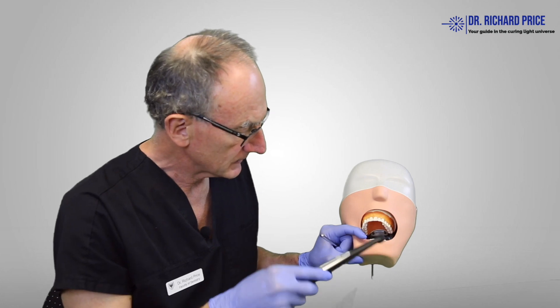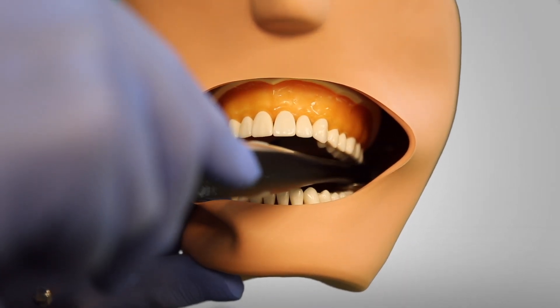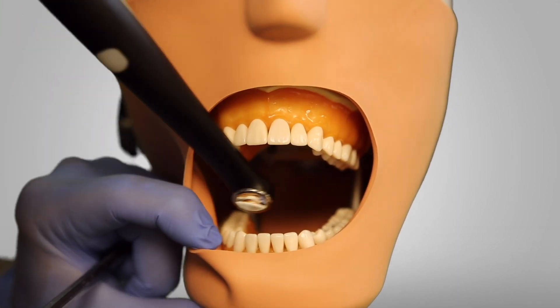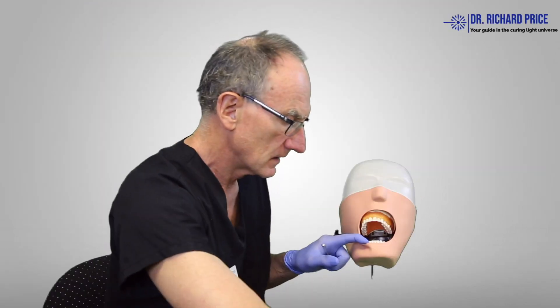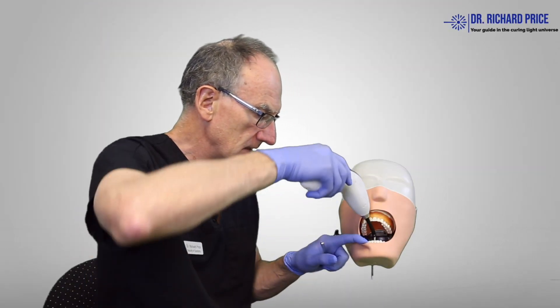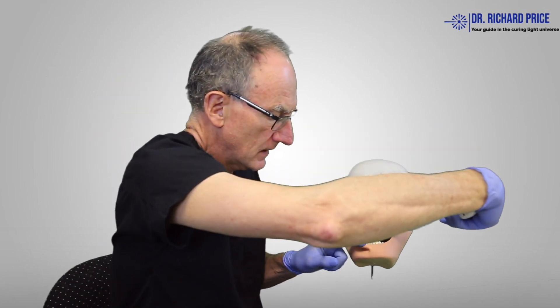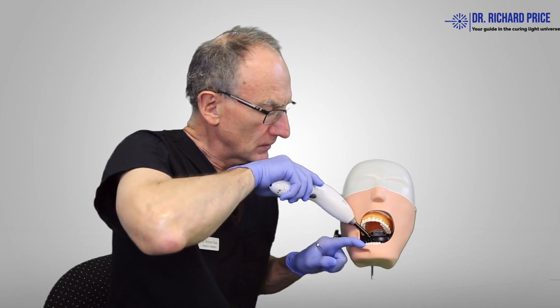The same thing applies to this one here — we can see how you can get into that back tooth quite easily. And it's not just the back tooth that's important; it's also the front teeth. Can you access the lower incisors? We try using this light here to try and access those lower incisors, and you can see how hard it is to get in there with that angle tip.